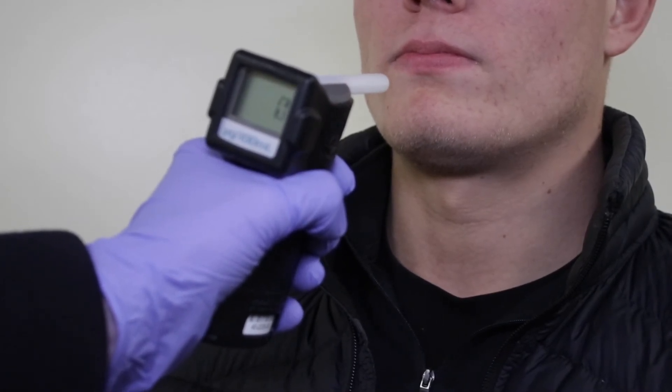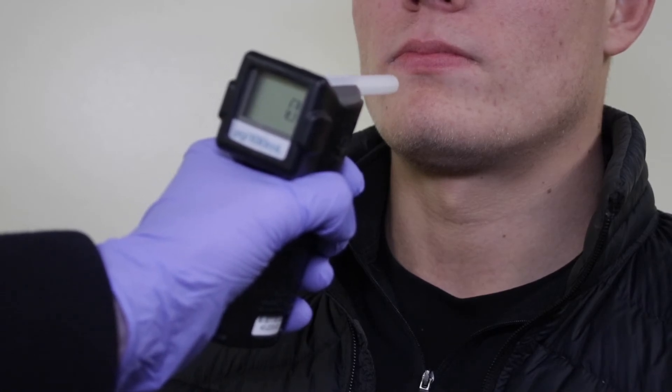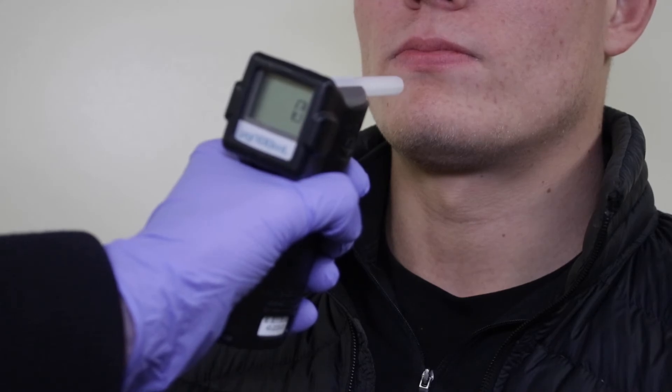The AlkaSensor FST will then display the result. Take a note of the result. The device will then give you the option to print the result if your device has a printer, or it will switch off.